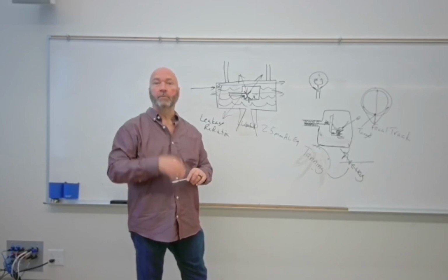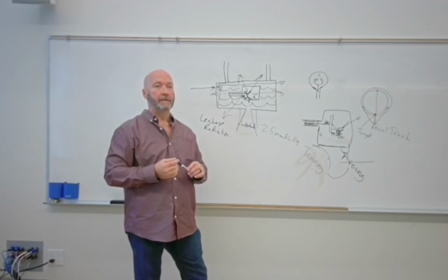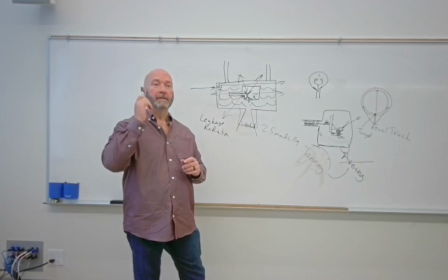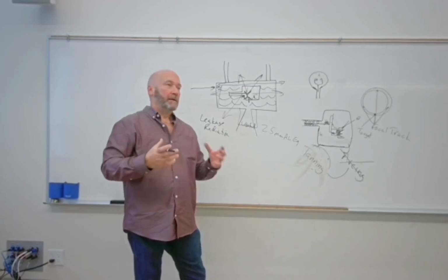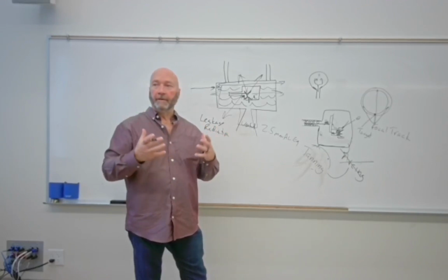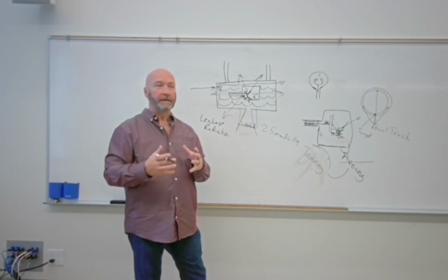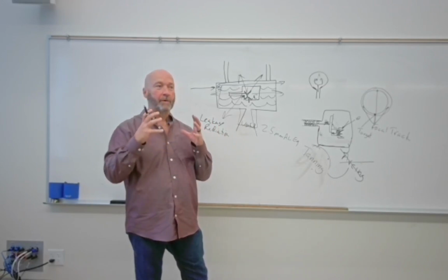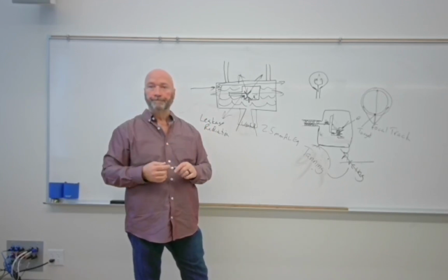Brems, exactly. So what does brems rely on? As it goes around the nucleus, exactly. Okay, so a large nuclear field is necessary to make it lose some of that energy, so doesn't it make sense that we want a big nucleus with a strong nuclear field?